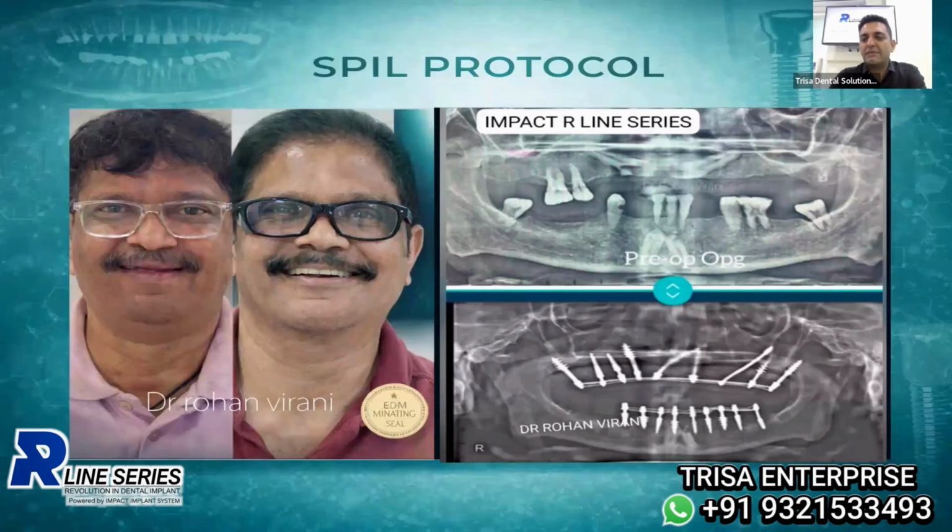But however, time and again, your clinic will be challenged by cases like this. Now, if you see this guy, not very economically affording, if I may use the word, having impacted canines, which takes away almost the anterior maxilla, which means that if I have to remove the canines, there will be a big defect, which is obviously beyond placing conventional implants or grafting.